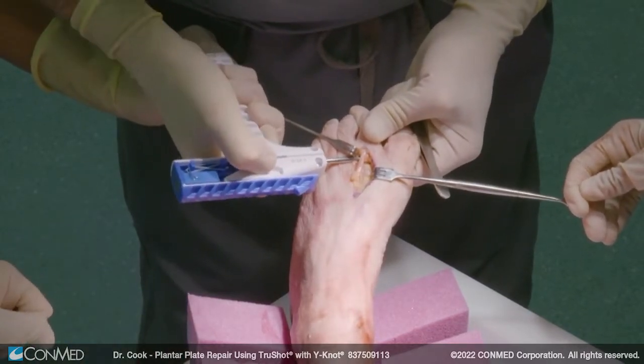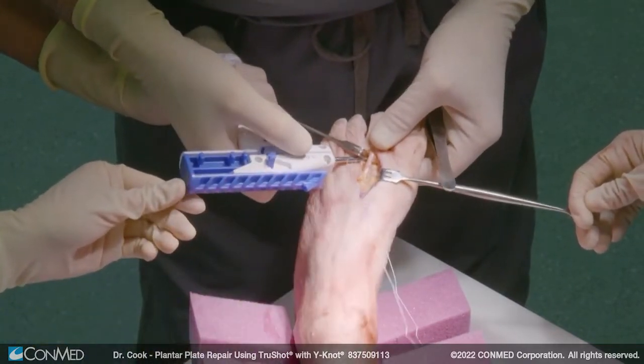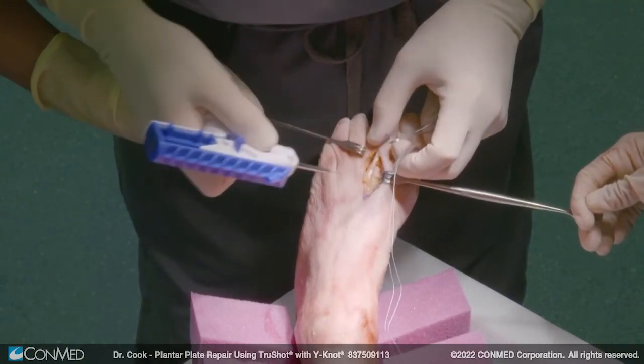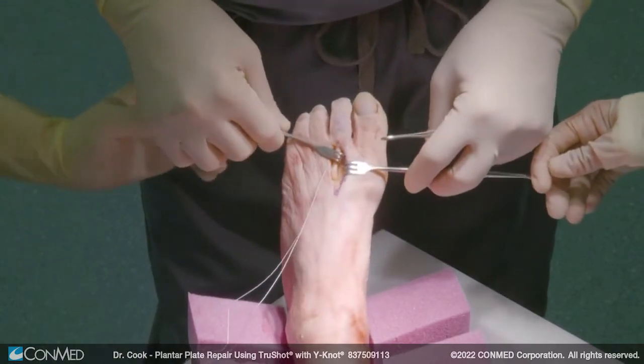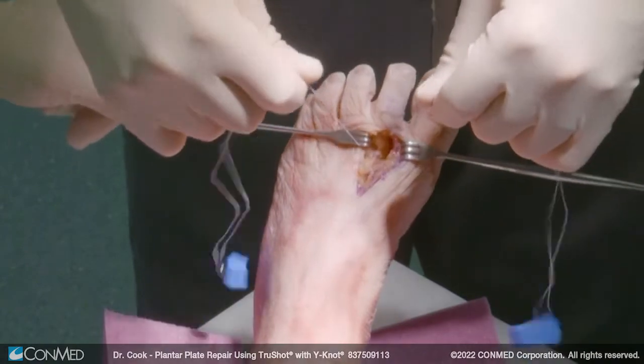Then we're going to pop this, undo everything, and pull it back out. That's one side, and then we're going to do the opposite side. Now we have our two suture anchors placed.